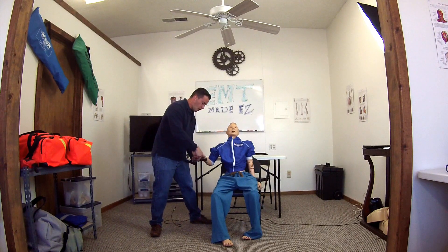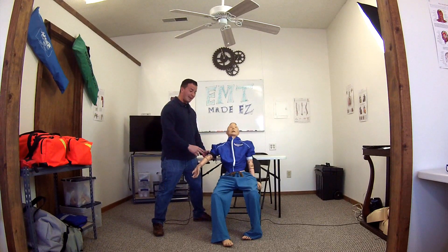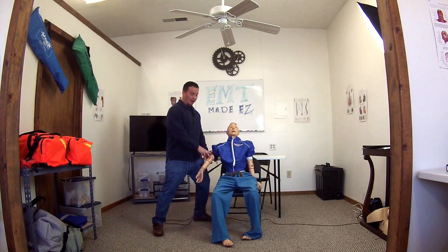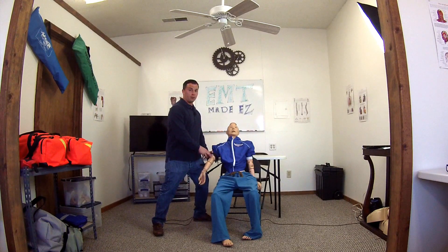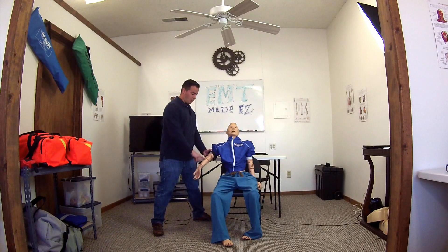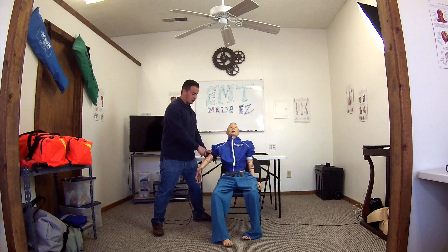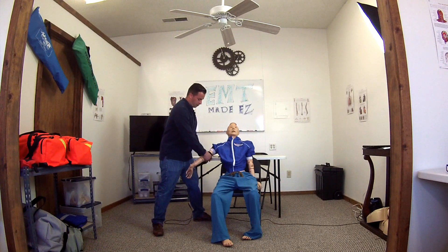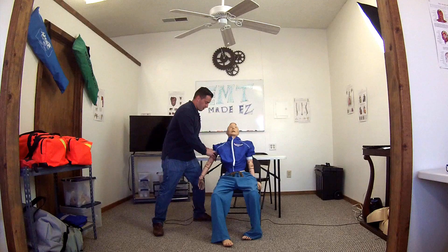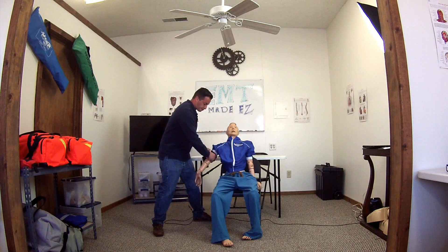Go ahead and put the tourniquet above the wound. It's very important that you place the tourniquet at least two inches above the wound. If the wound is close to the elbow, go right above the elbow — don't get close to any joint because that may make the tourniquet come loose. I'm going to put my tourniquet well above the elbow; if you want to be safe, always go above the elbow and they can't dock you for it.